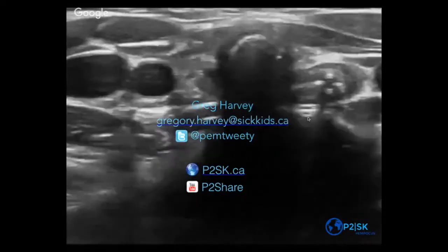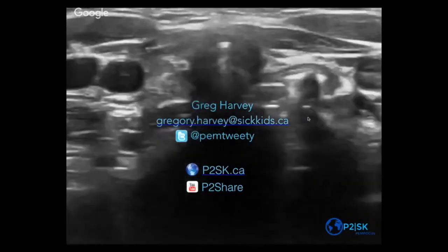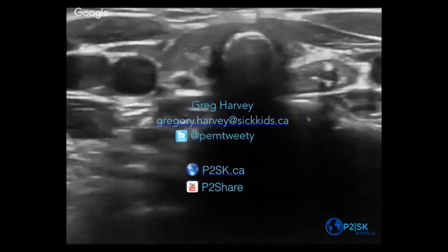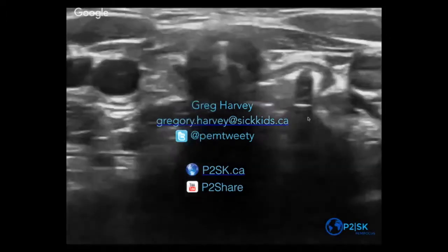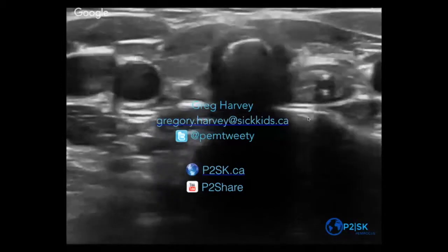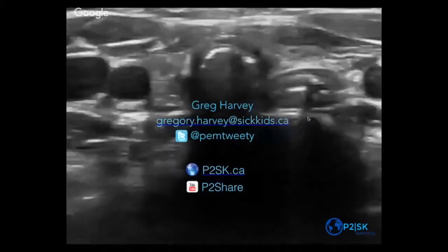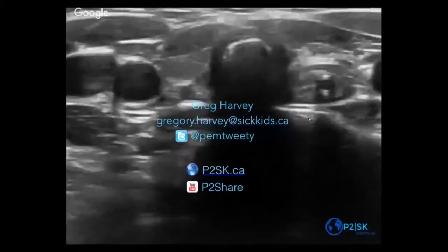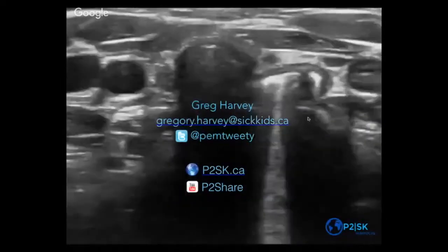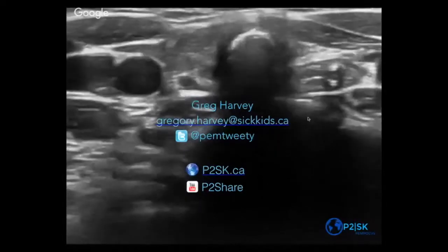One setting where you could see a persistent shadow would be if someone has a food impaction — then they can have a dilated esophagus filled with air, but that does look a little different. As a rule, you're briefly seeing that bright structure, and then you see it again. If you're looking long enough, you'll be able to tell there's not a persistent shadow down there. That bright structure is more akin to a B-line where you've got some fluid and some air interacting, giving you that kind of spotlight down.